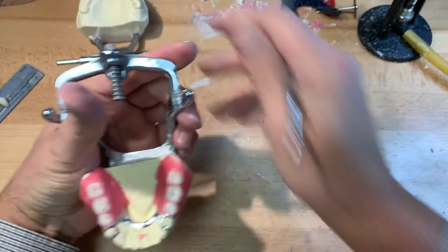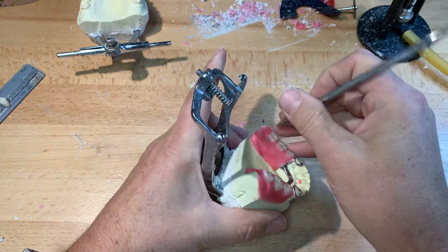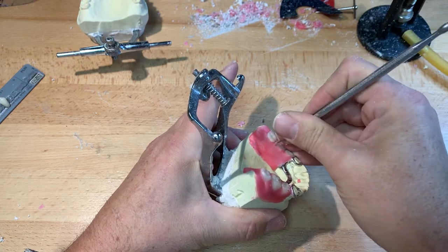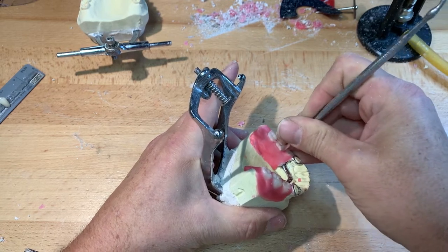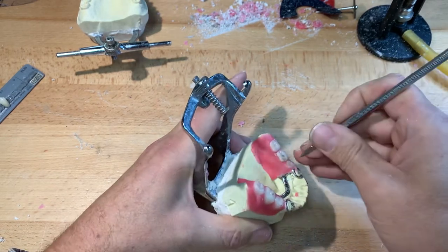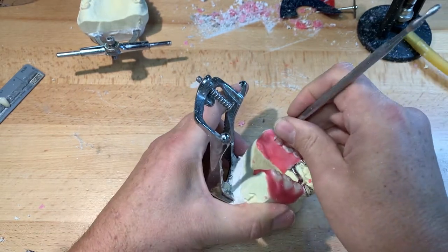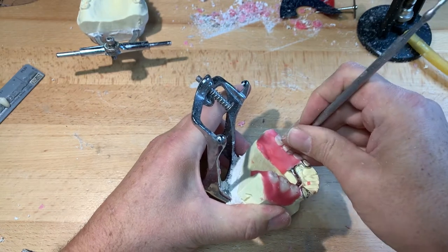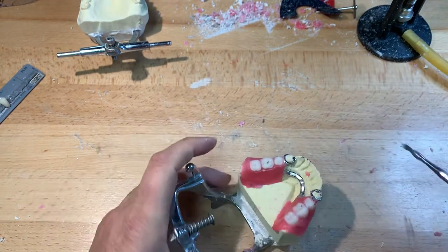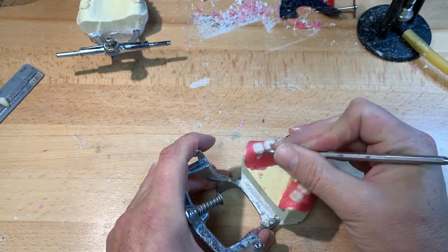I've added a substantial amount of wax around the denture teeth, buccal and lingual. I'll start with the lingual side. I want a clear demarcation — a definite difference — that the lingual gingival margin is equal with no undercuts. I'm thinking of myself polishing this case: I don't want to dig below the denture teeth and create an undercut that I can't trim or polish, or I'll end up polishing denture teeth.